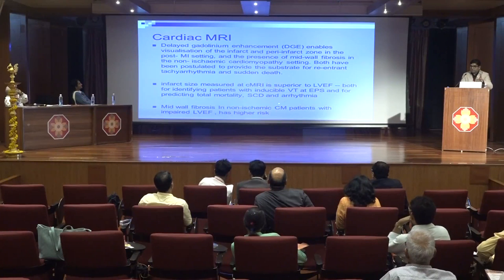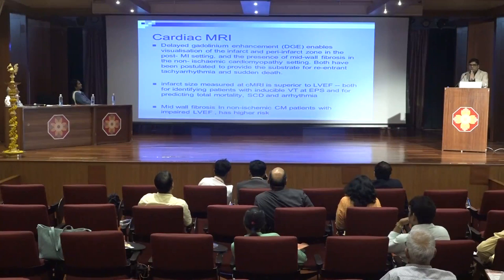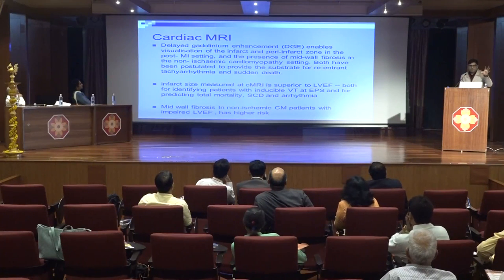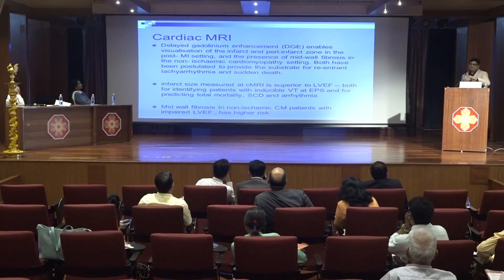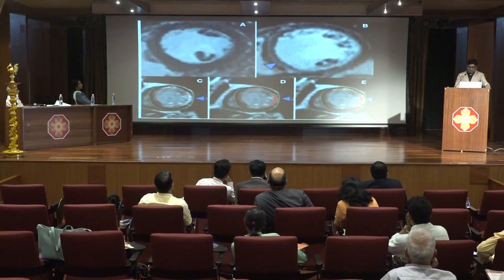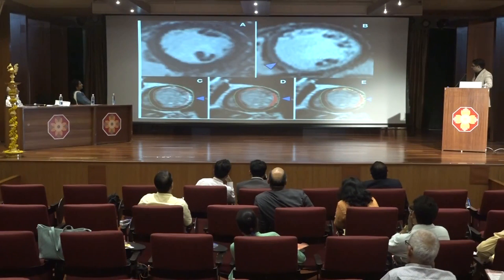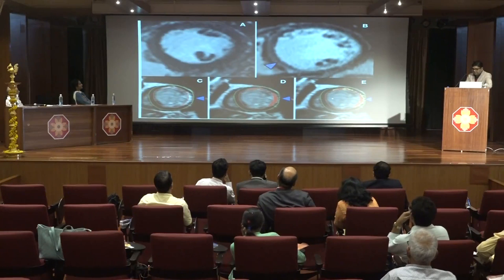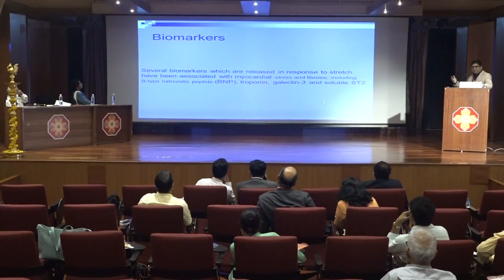In non-ischemic cardiomyopathy patients, there will not be much scar. However, if you do the cardiac MRI and see mid-wall fibrosis, be careful — warn your patients and start taking care of them in a much better way. This is a cardiac MRI image showing gadolinium uptake. This is the one showing defective uptake, and on the basis of that as well, you can risk stratify those patients.